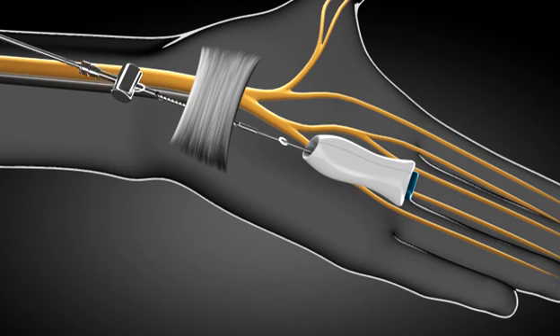Next, the access cannula is withdrawn and the blade lock is secured to the Manos carpal tunnel release blade assembly. This prevents the carpal tunnel release blade assembly from exiting the palm.